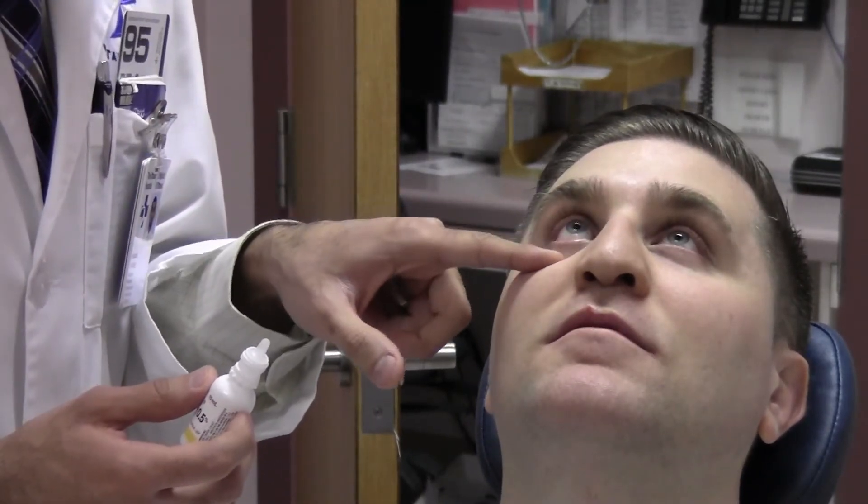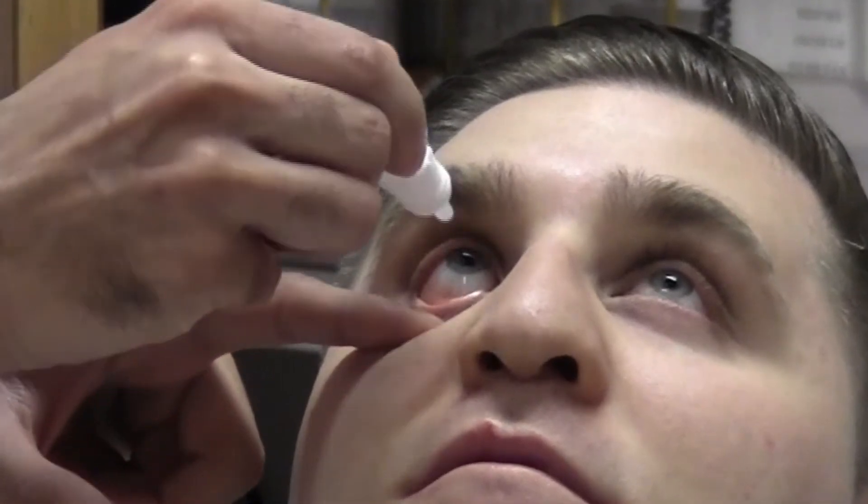Before checking the pressure with the tonopen, it's necessary to anesthetize the eye with some alcaine. Have the patient look up, then lower the inferior lid and put a drop in the fornix, just like that. Then release the lid and give a few seconds for the drop to take effect.